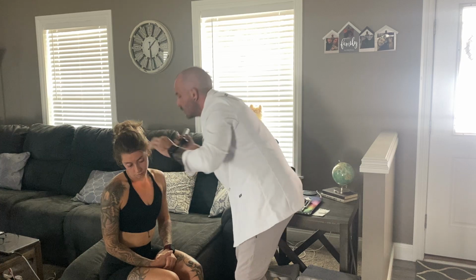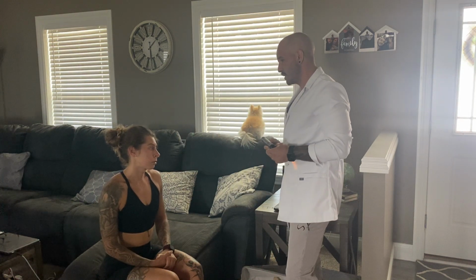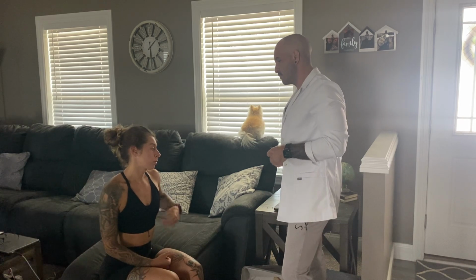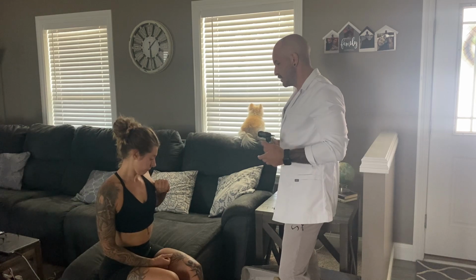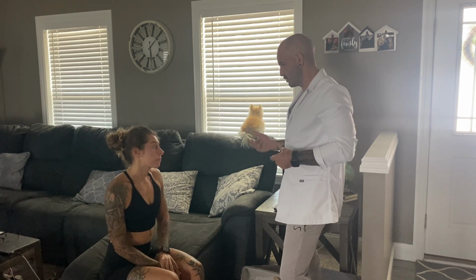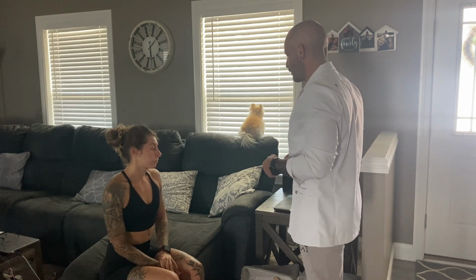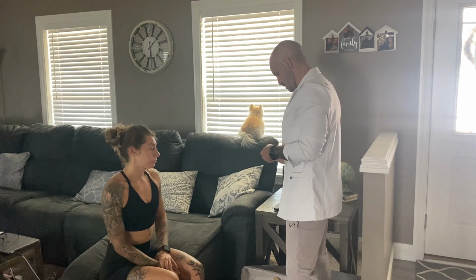Okay. All right, so tympanic membrane was seen on both sides. The cone of light was below the malleus. I didn't see any edema, I didn't see any perforations in the tympanic membrane. It was a pearly gray color on both sides bilaterally, so all those are normal findings.